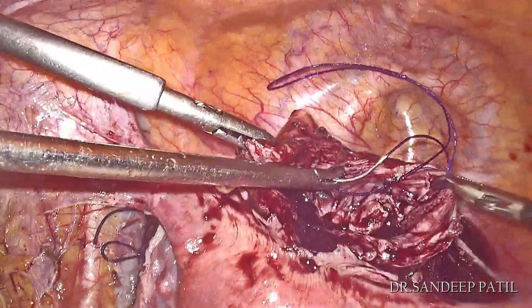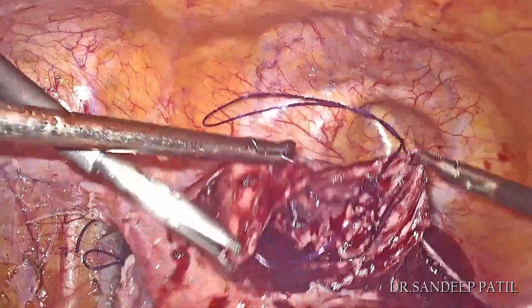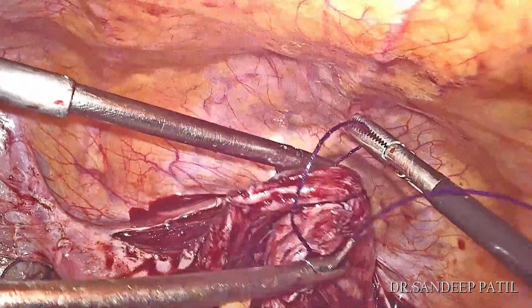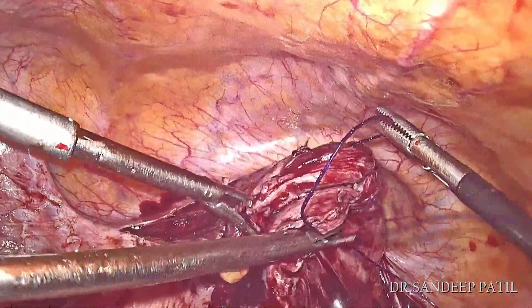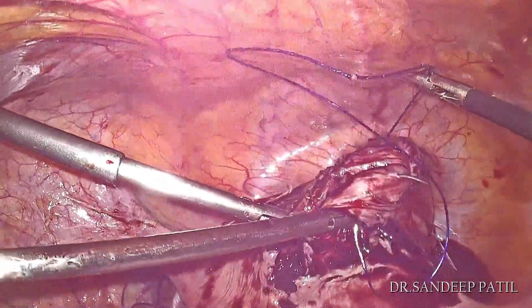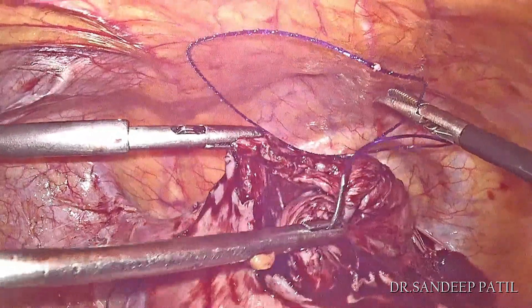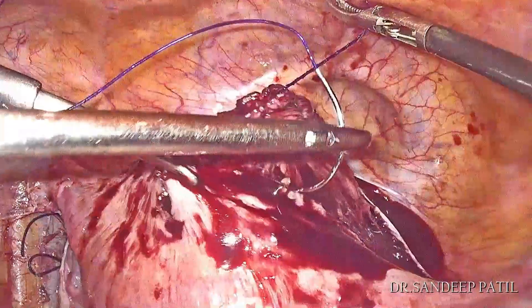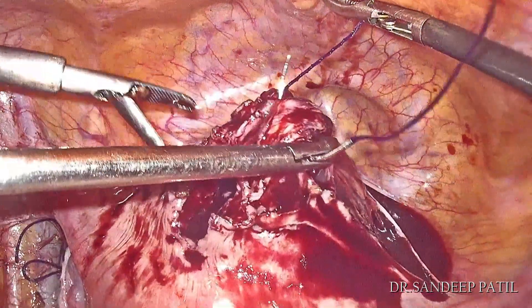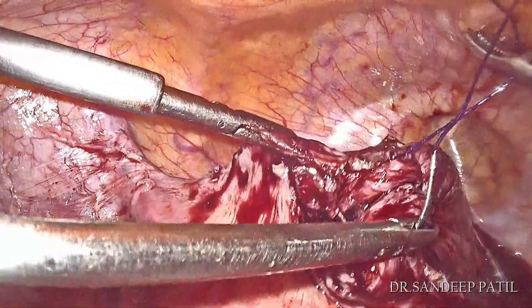No knotting is required which reduces surgical time significantly. The barbs provide consistent tension along the suture line ensuring that the wound edges are approximated evenly. This helps in achieving better wound healing and reduced scarring. The self-anchoring features allow us to have better control over tissue approximation leading to more precise and secure closure.